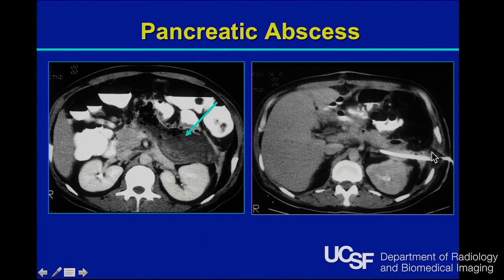In the cases of peripancreatic infections, a lot of the time, yes, you can drain them. We certainly drain them at UCSF all the time. You might need to put in a large bore drain, and you might need to be prepared to change these drains all the time, because this is very thick, tenacious material.